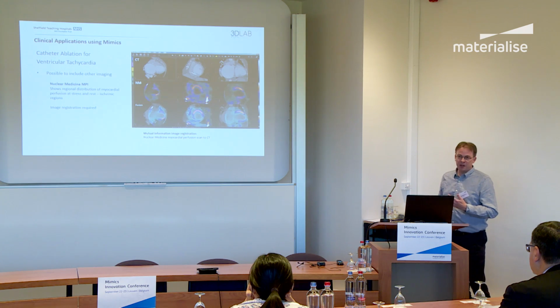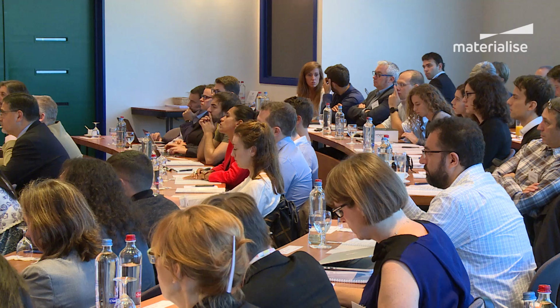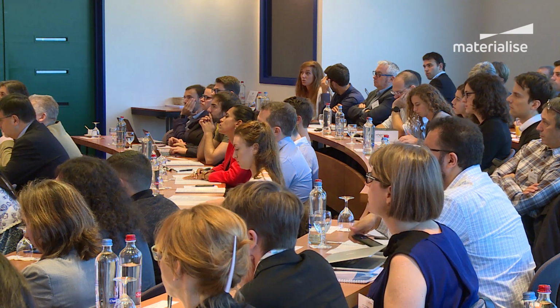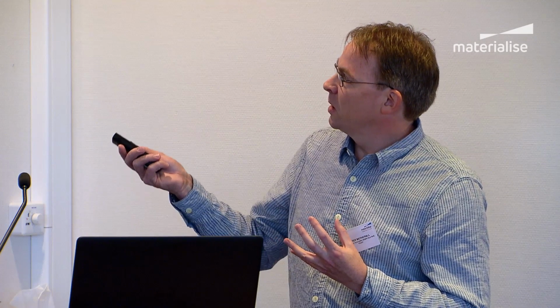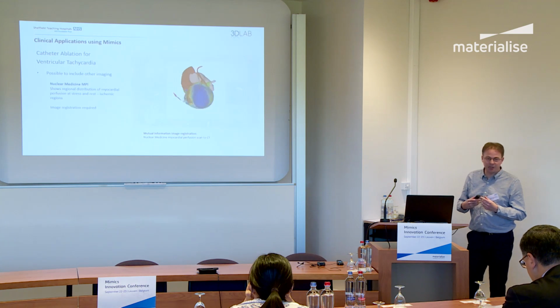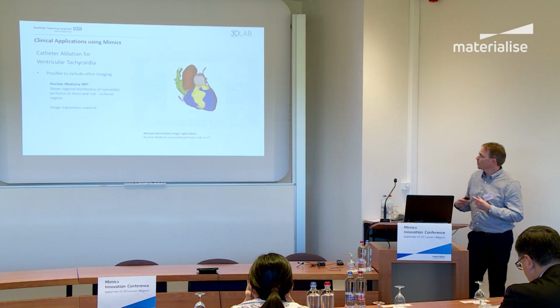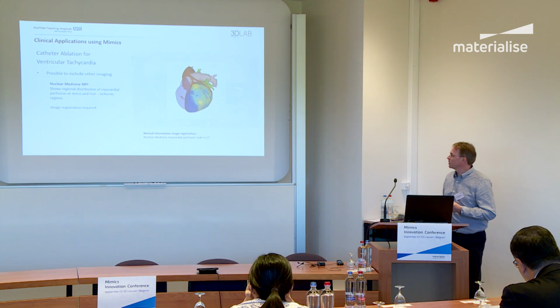We've been able to combine multiple modalities as well, so not just CT. In this case, we've got nuclear medicine myocardial perfusion imaging registered to the CT. And from that, we can then produce a model where, again, this is going a bit fast, the yellow and blue phase there is the myocardial perfusion scan. And we can see that we get good correlation between the myocardial perfusion scan and the wall thickness, which is what you kind of expect.